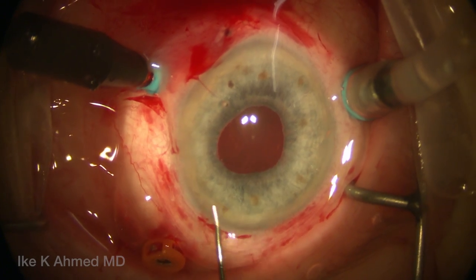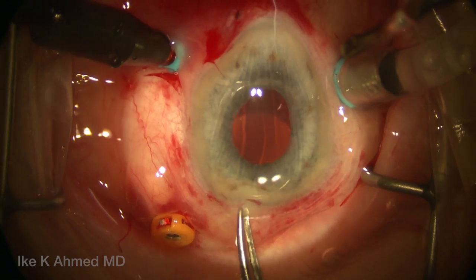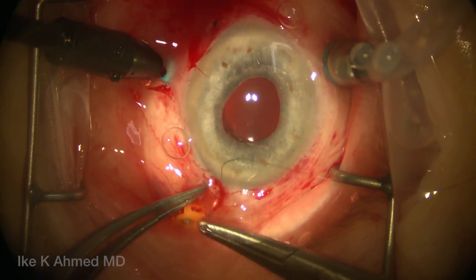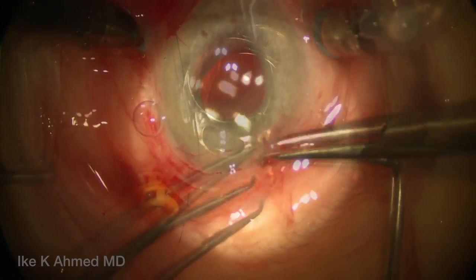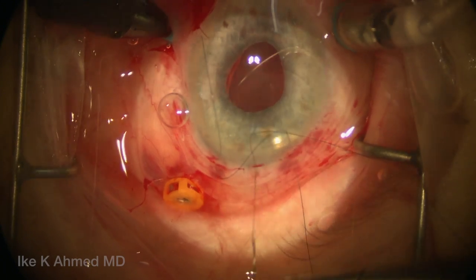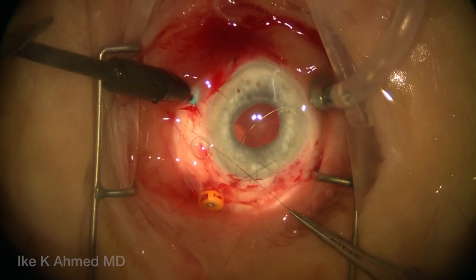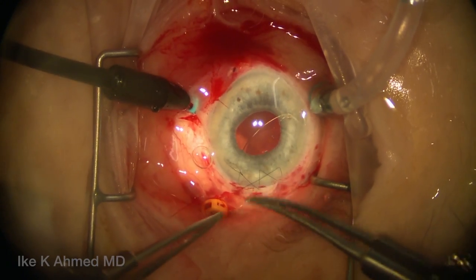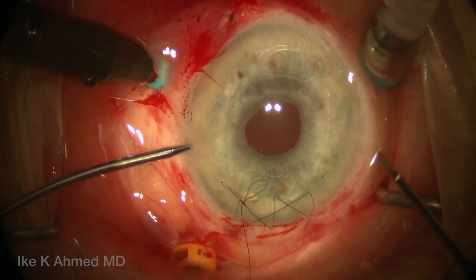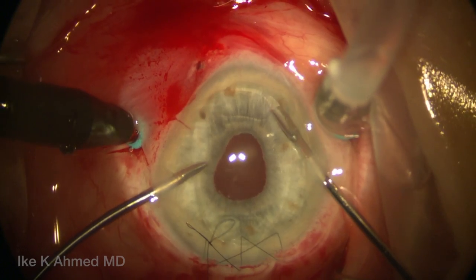When ready for the artisan iris claw lens, further cohesive viscoelastic is injected in the anterior chamber. The artisan lens is placed through the 6 mm incision, and we immediately suture this temporarily with 10-0 nylon using a 3-bite overlapping suturing technique. The suture is tied temporarily and will be finalized after the IOL has been fixated. It's important to keep an eye on the infusion — if we lower the bottle height, we may stop the infusion for a period of time, depending on our needs.